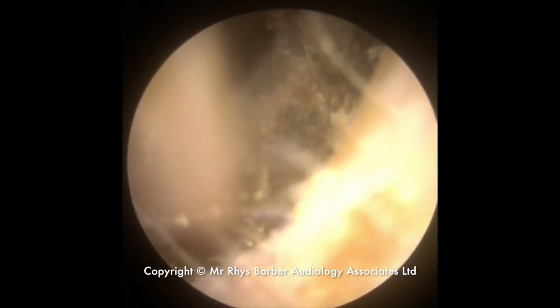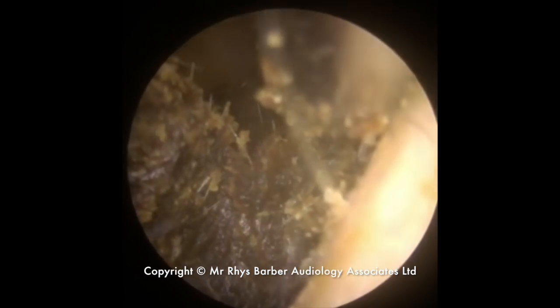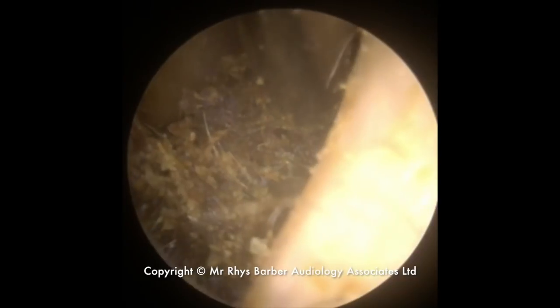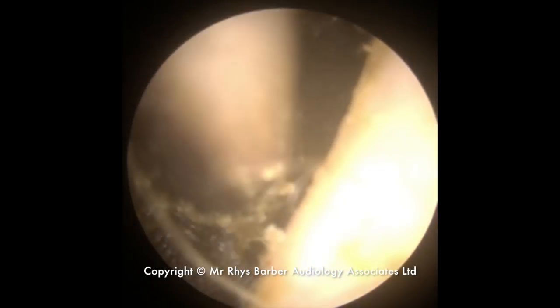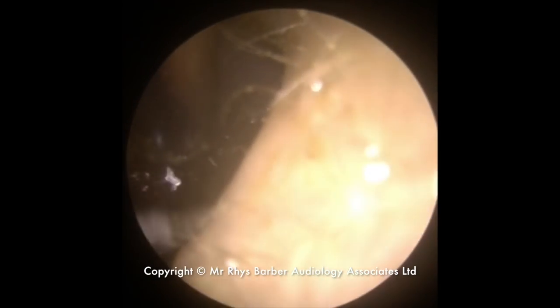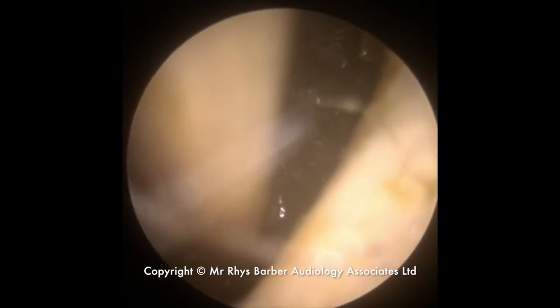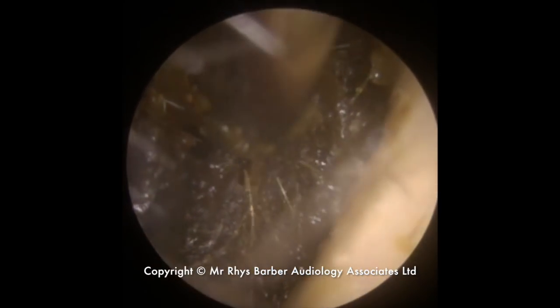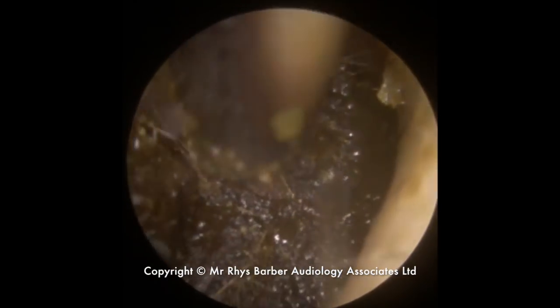Just trying to fold it all into the centre of the wax, and also to loosen it. Sometimes when you get a grip on the base section of wax and lift, it will detach quite a bit of it off the canal wall as well. Rather than trying to pull it from the back forwards — which can stick it to the canal wall — we're trying to lift it off and take it out in a bigger piece. We'll put some olive oil into the canal, which just reduces the stickiness and the adhesion to the canal wall, helping us to sometimes get this out in one piece.